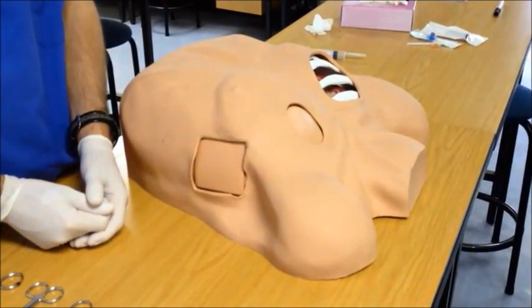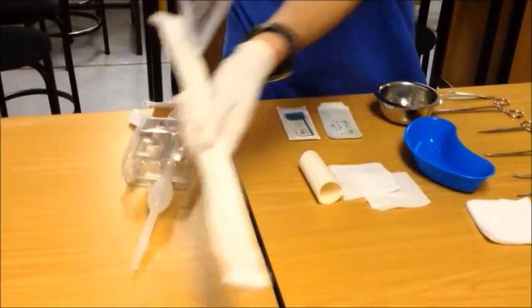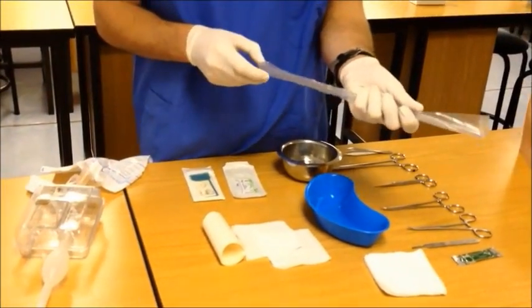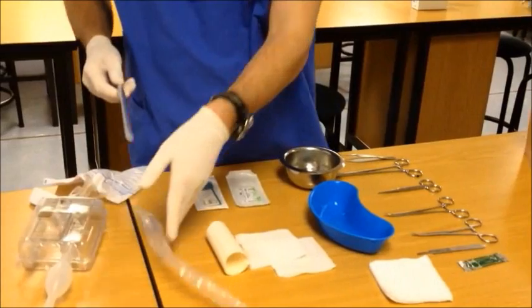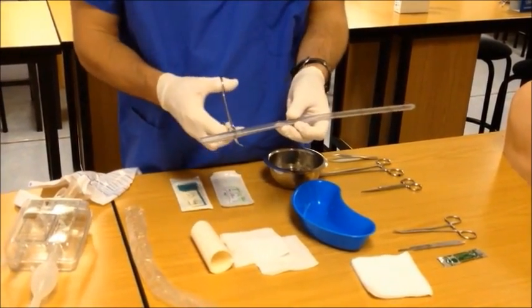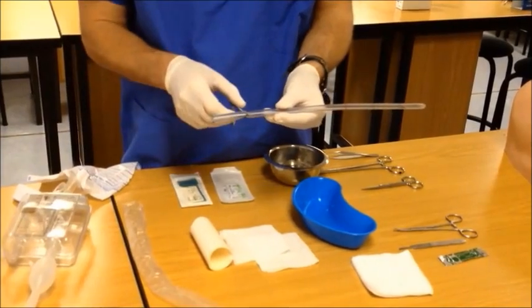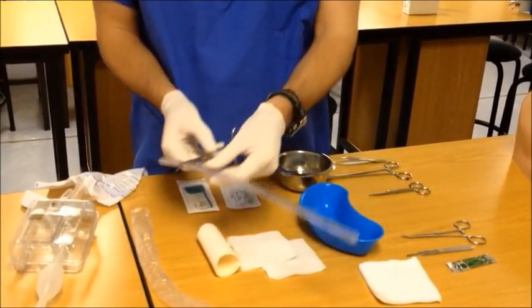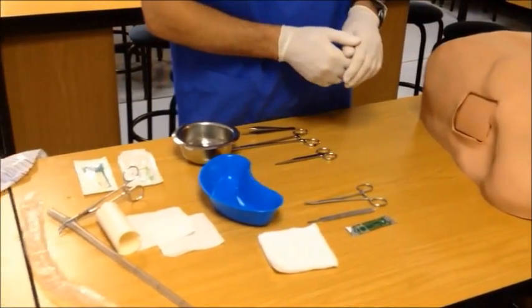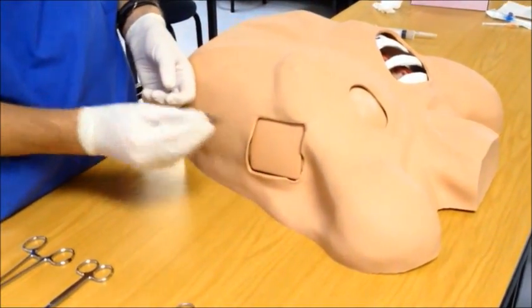While the local anaesthetic is working, prepare the rest of your equipment. Remove your chest drain from its sterile packaging, maintaining sterility in your field. Prepare the chest drain for insertion by taking one of your artery forceps and closing off the back end — this will eventually prevent uncontrolled gushing of the contents of the chest cavity onto your sterile field or onto yourself. After having given enough time for the local anaesthetic to work, test the area of skin and ensure good analgesia.